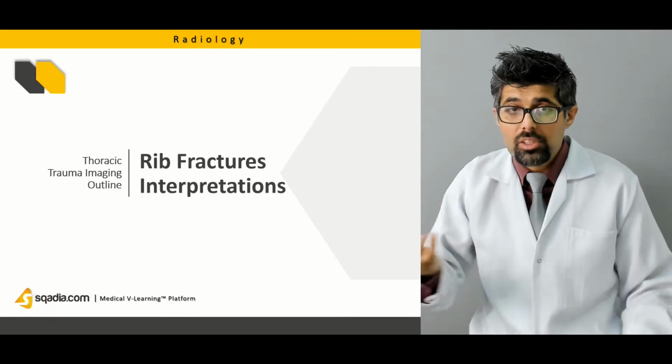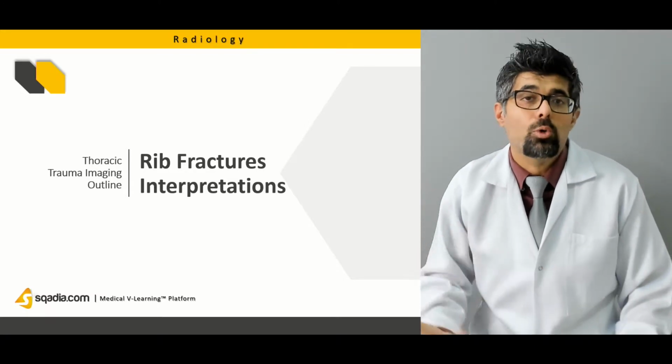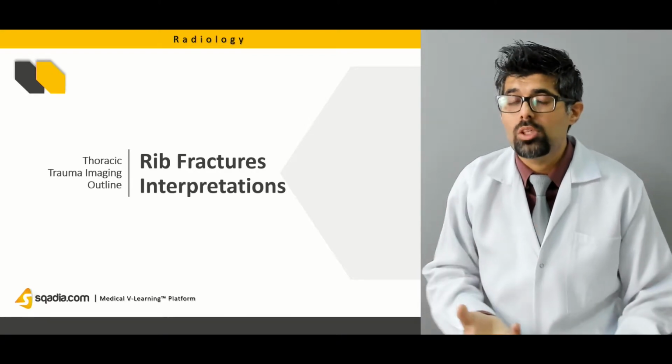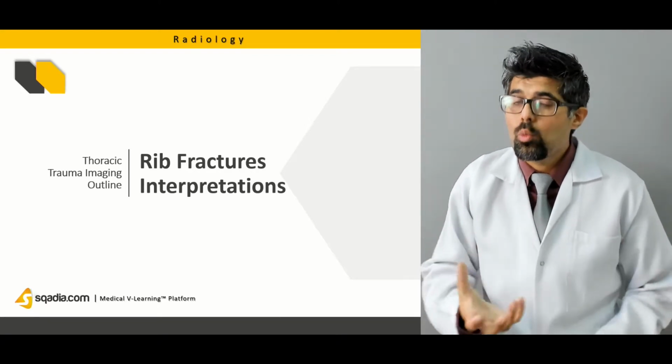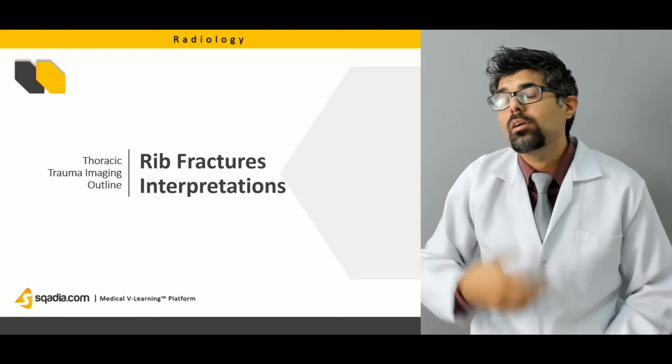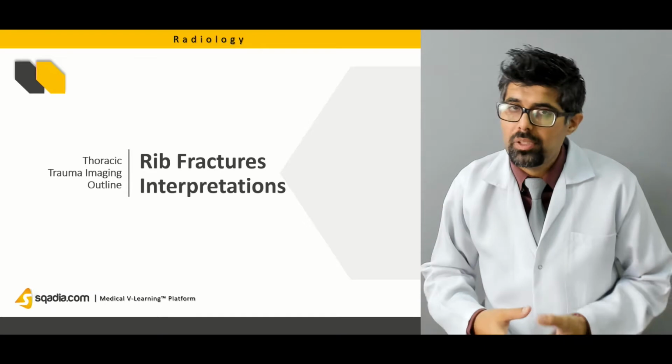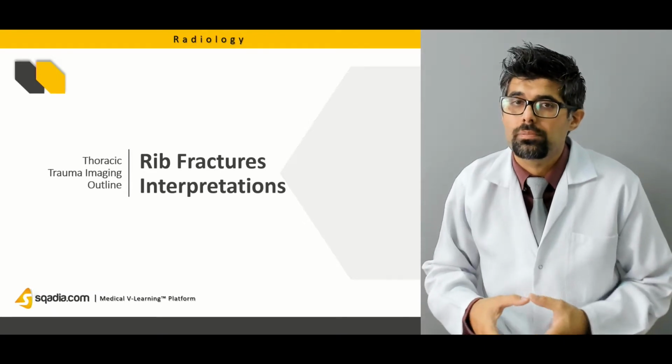Now, if there is a rib fracture, how to interpret it? Which organ is punctured? How much is punctured? How much, to what extent, what happens? All of these interpretations will be discussed in the lecture.